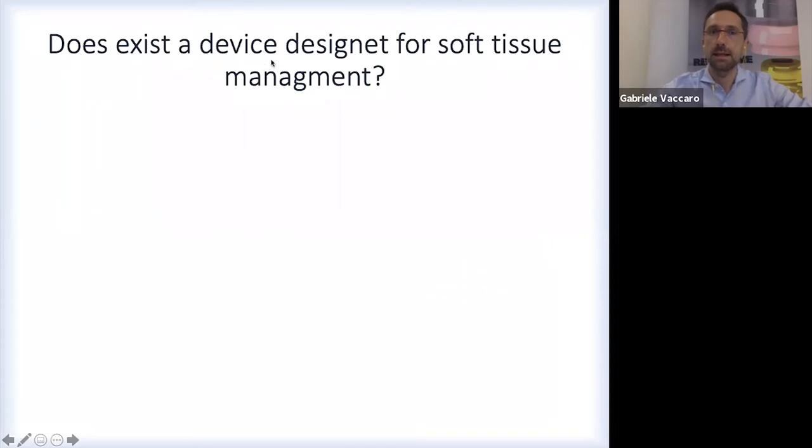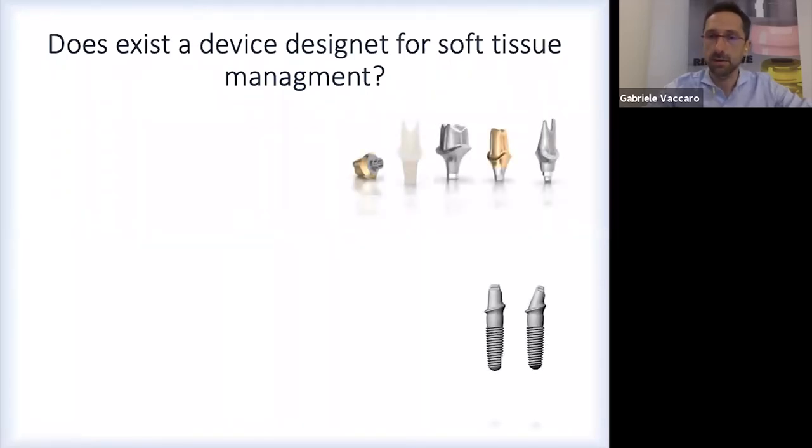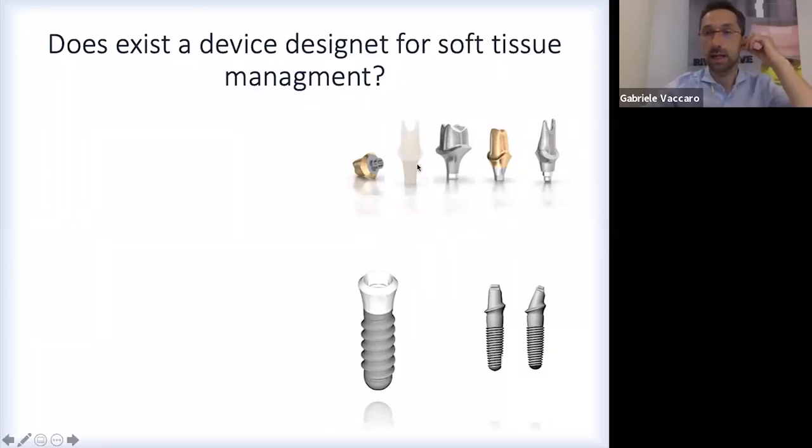But does a device designed for soft tissue management exist in the market? Yes, I can say yes. It's a long time that this exists, and we are very expert in this. But they are very expensive for single teeth, and they are a good solution for single tooth, like these custom-made abutments. They are very time-consuming. And they become very expensive when we do it for multiple implant-supported fixed prosthesis.